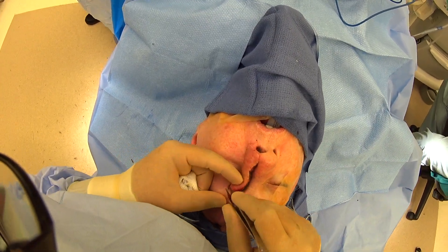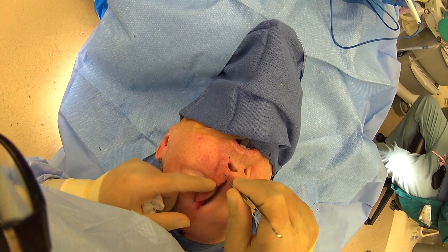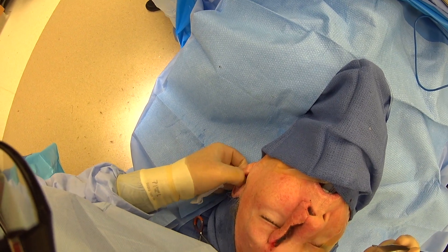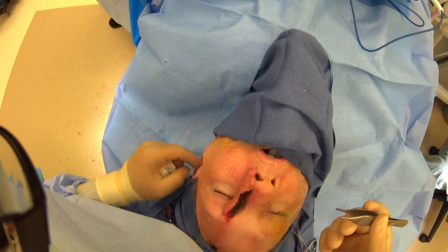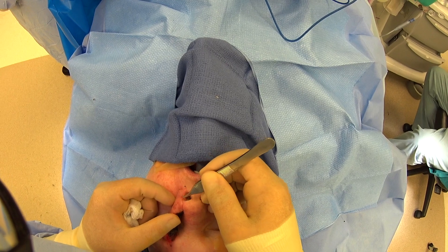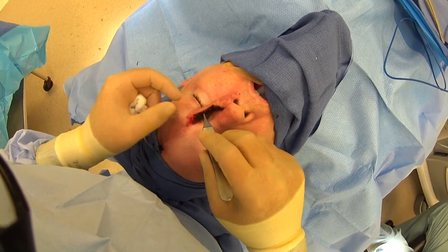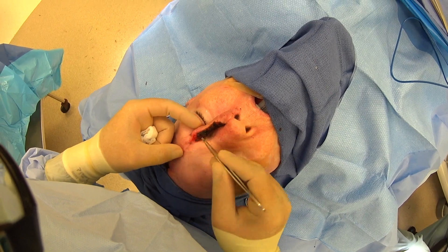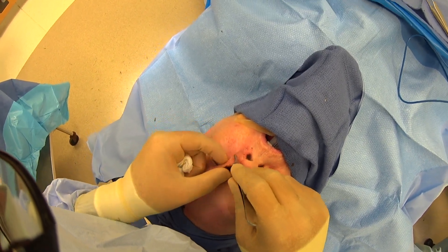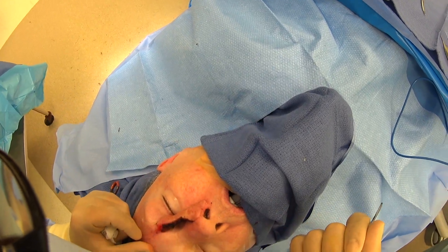Here we are three weeks after our forehead flap. We've done this to reconstruct the nose from a nasal skin cancer — she had lost this whole portion of her nose. We took some ear cartilage, as you can see in part one; here are some remaining sutures where we closed the back of her ear. We've redone the entire nasal ala here. Now we're going to take off the unwanted portion, fold back the remaining skin, and then you'll see how we contour and thin it so it looks like a nice even course matching the opposite side.